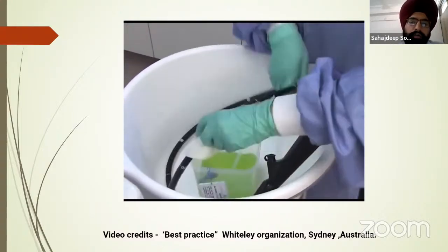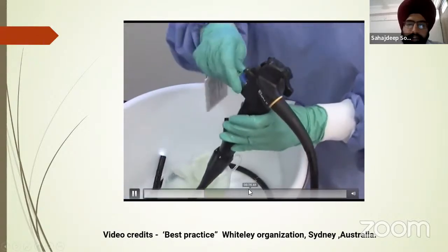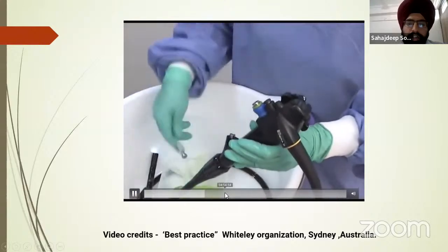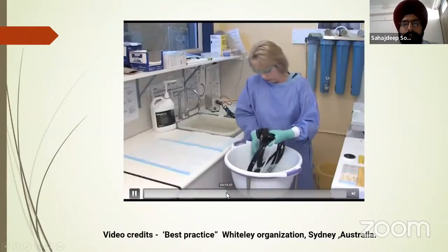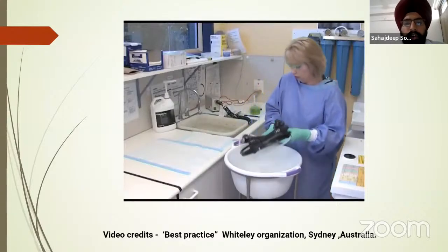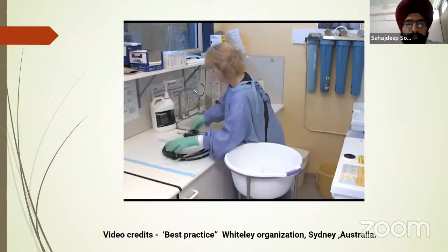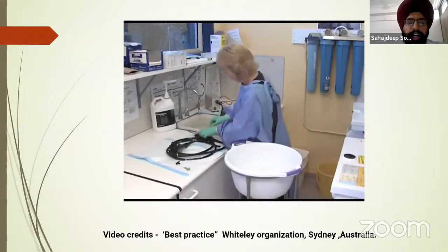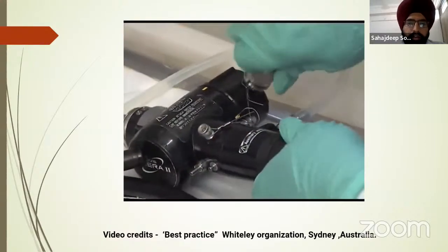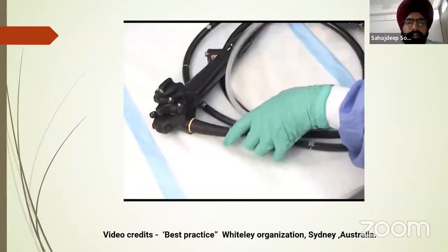using a wet cloth which has been immersed in a detergent solution. Then comes the most important point of leak testing. Here first we remove all the biopsy caps and flushing adapters, and then we attach the leak tester or pressure instrument to the venting connector.